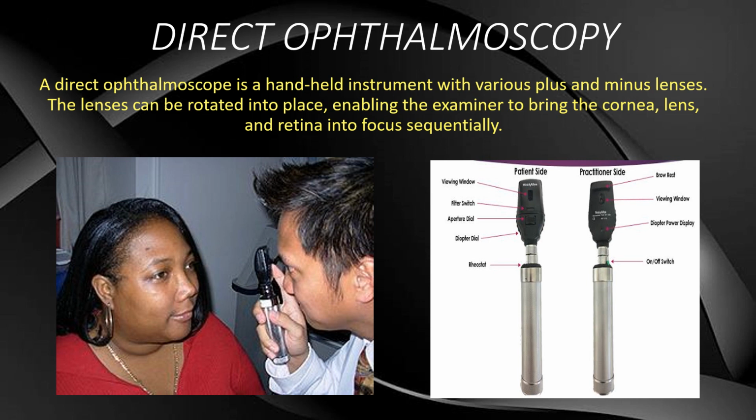During this examination, the room should be darkened and the patient's eye should be on the same level as the examiner's eye. The patient and the examiner should be comfortable and both should breathe normally. The patient is given a target to gaze at and is encouraged to keep both eyes open and steady.